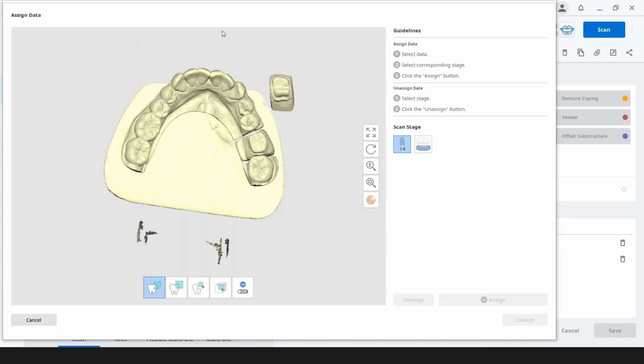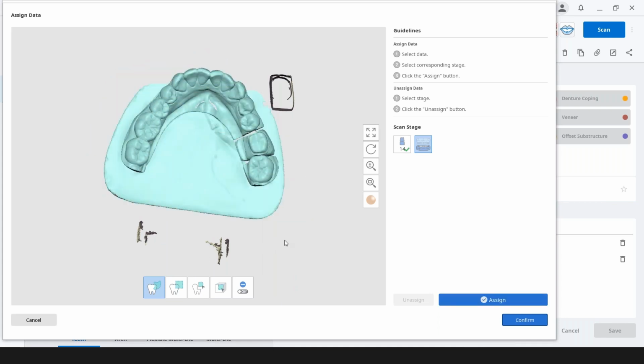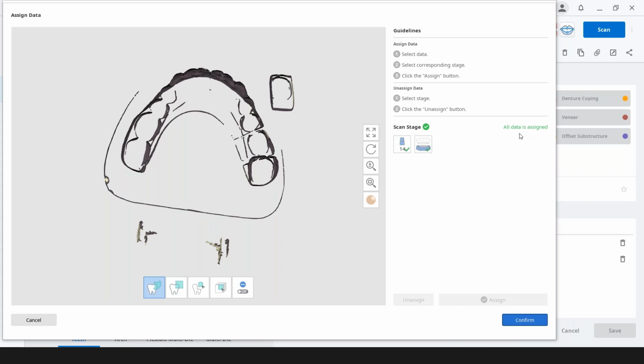There we go. All right. Yeah, that was quick. 14 again. Assign. Lower model. Perfect. So these other things that are in there, that's the articulator and so forth, that could ask if you want to continue sometimes. Got it. Assign. All data is assigned. You got the 2 green check marks. Okay.